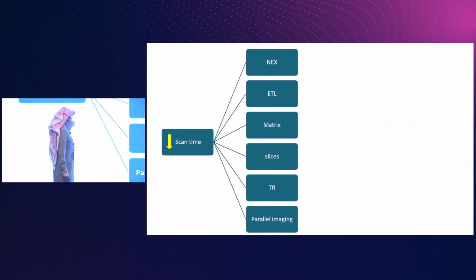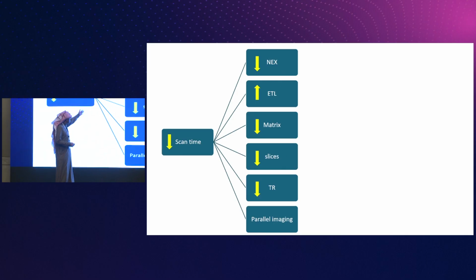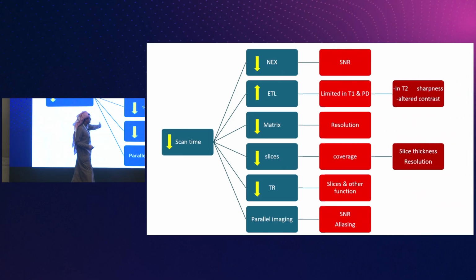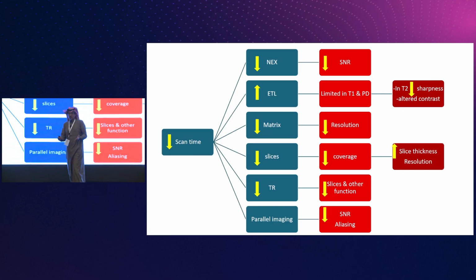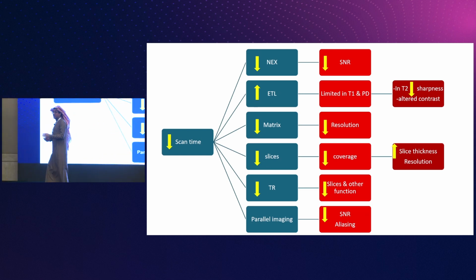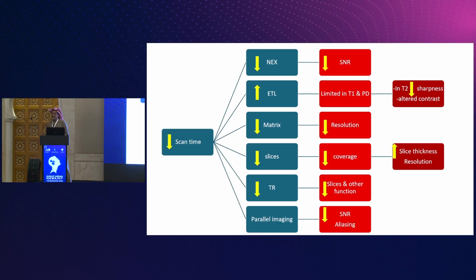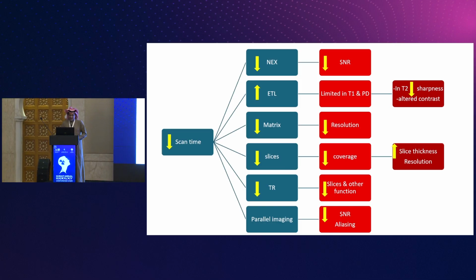For example, to decrease the scan time, I need to make changes to these parameters, and then I will end up with changes in another parameter. I'm not going to go with what you expect. Here, I would like to engross your attention to a different angle of how to manipulate the parameters.